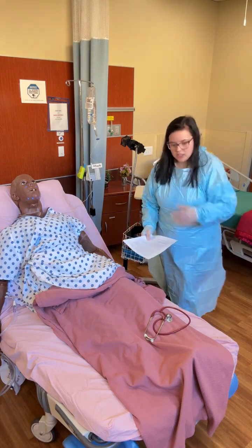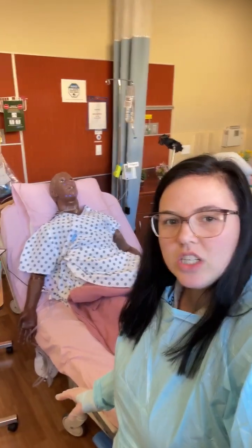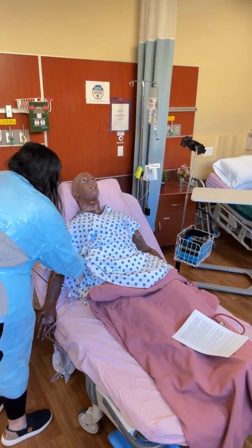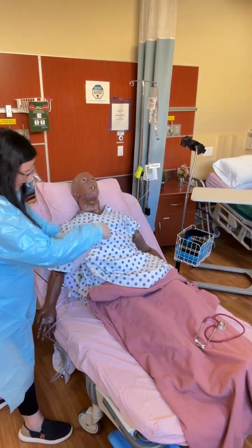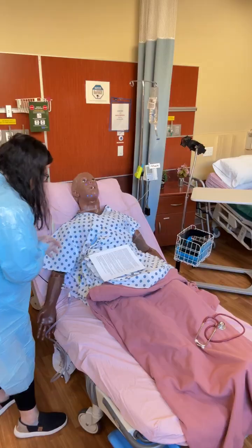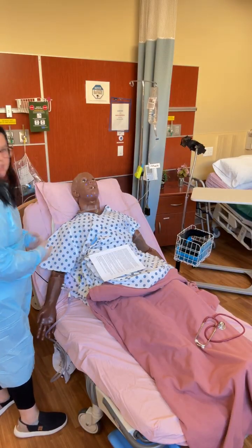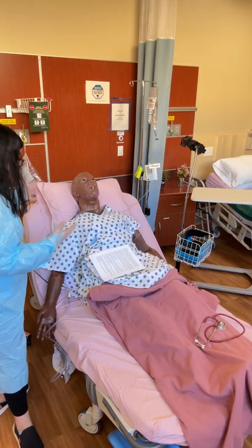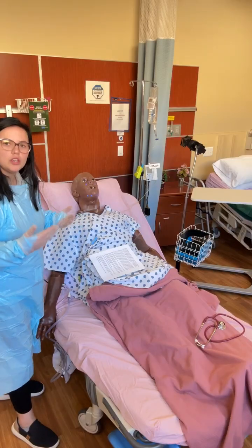So if we come over to the other side of the bed here, and again, we'll just stay on this side briefly, but we see that our patient has an IV here. So you can say, I am assessing the patient's IV site. Do I see any redness? No, you do not. Do I see any edema? No, you do not. Okay, so you guys just go through what you're looking for.